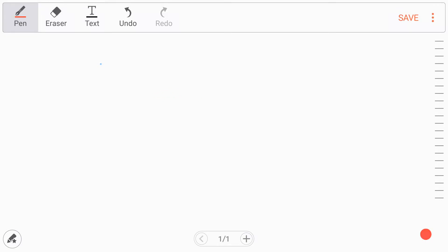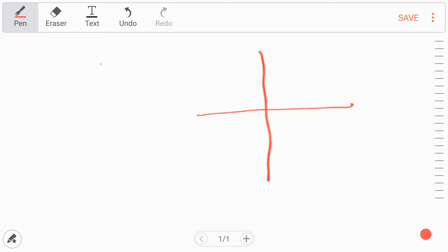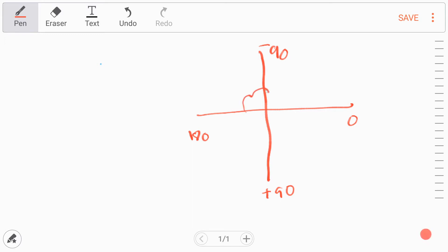Hi guys, welcome back. In this video I'm going to explain the axis of the heart. To understand it, try to draw two perpendicular lines. On the upward direction mark it as minus 90, and opposite to that is plus 90. On one side mark 0, and on the other side it's going to be 180. The heart fits into this coordinate system.